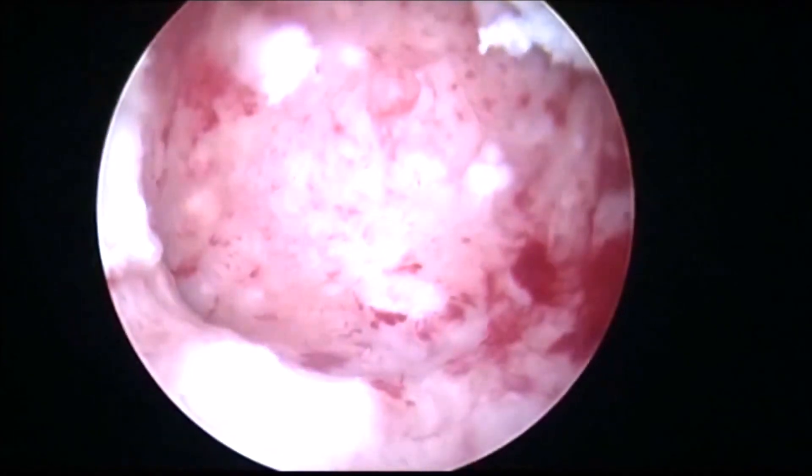For polyps also it is good. If you have bleeding after removal of the myoma, you can use the bipolar electrodes or the roller ball to stop the bleeding. We can see the cavity is clear and the myoma is out.